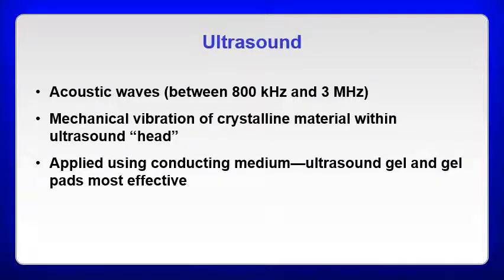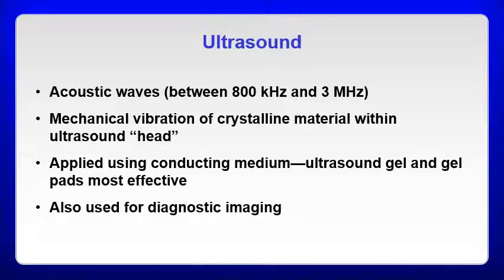And it's going to be applied using a conducting medium. The two most common conducting mediums are ultrasound gel and gel pads. They tend to be the most effective. There are some other conducting mediums that do get utilized, and we'll talk about some of the benefits and drawbacks of them.